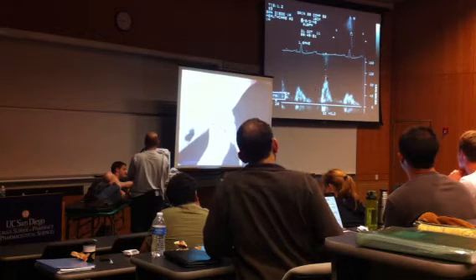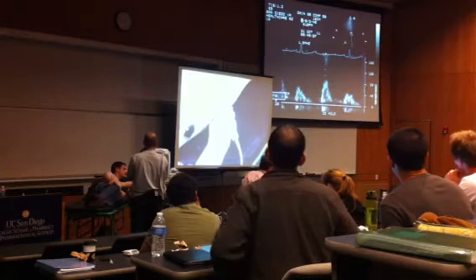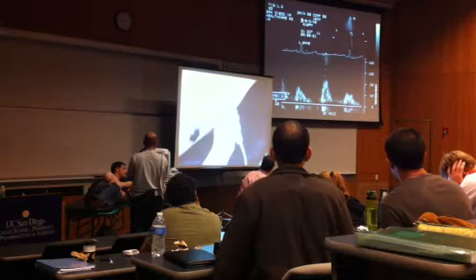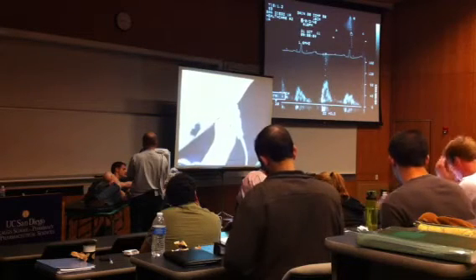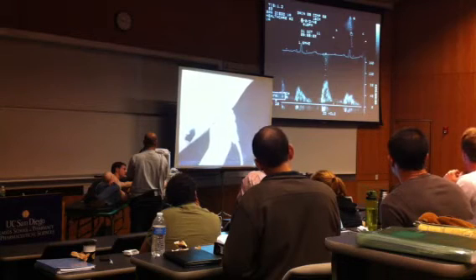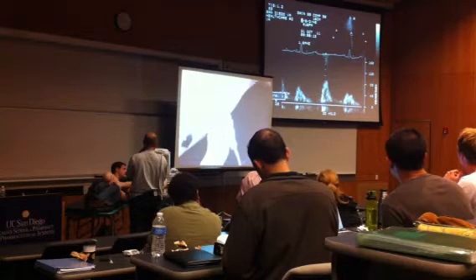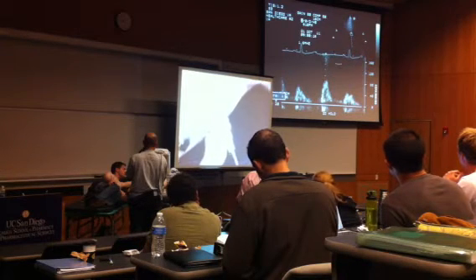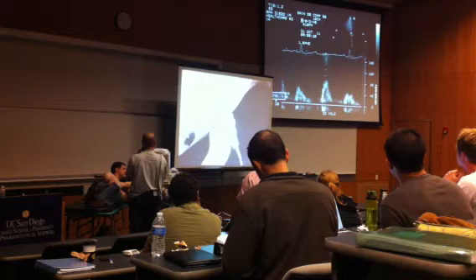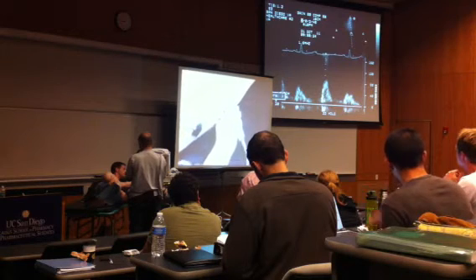So we have flowing of blood because of the pressure differential, where I talked to you yesterday about even a suction gradient into the left ventricle that produces this early filling. We then have a period of relaxation as pressures begin to equilibrate. We have electrical activation from the sinus node. The atria get stimulated and contract, and subsequent to that P wave an A wave develops. And so we can get cardiac cycle events from our echo.